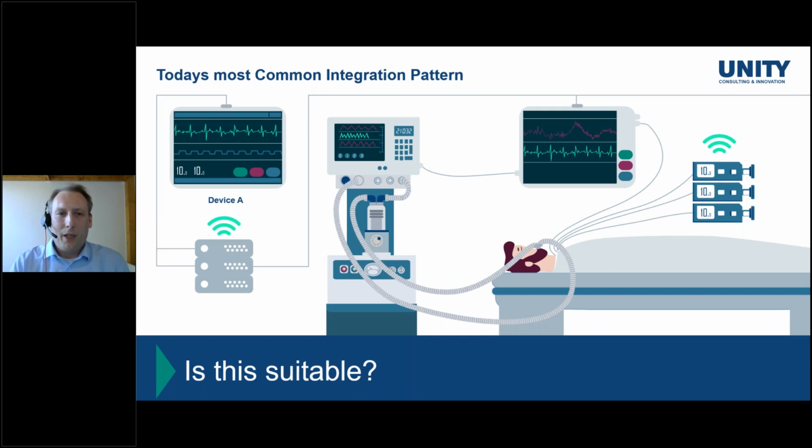If we are lucky, then this kind of gateway maybe has an IHE DEC or ACM interface, but most likely we would find some kind of a proprietary API. For the infusion pumps depicted here on the right side of the picture, it would be more or less the same setup. Maybe they are wireless, which is very common nowadays, but they would also have some kind of a gateway where you could access the data.